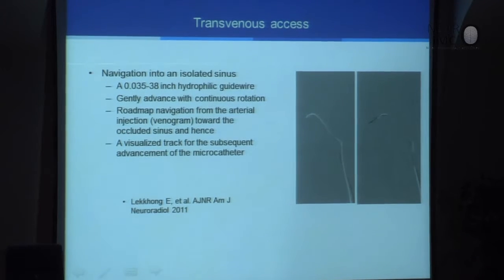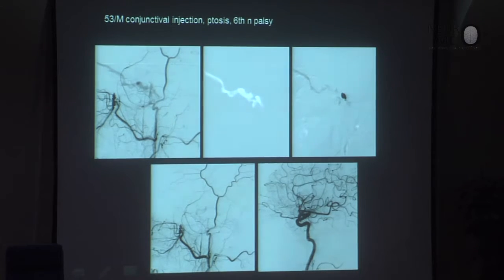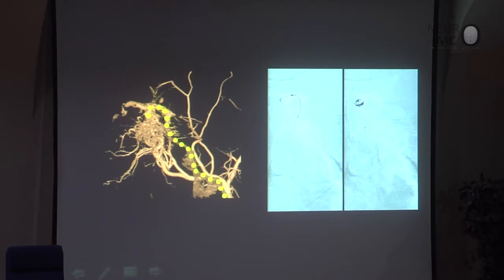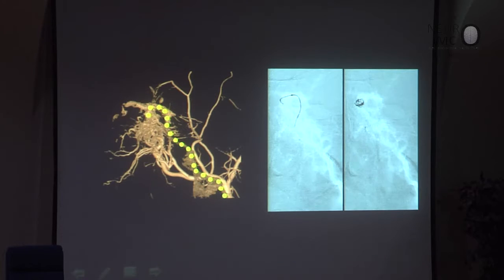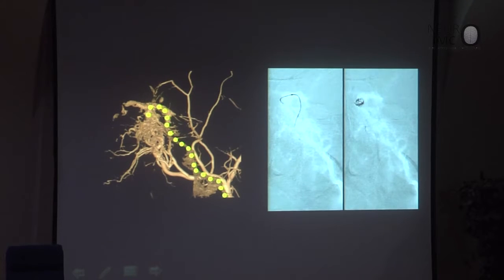We usually try transvenous access, as you see here. This procedure is most effective in the restrictive phase because antegrade venous occlusion is there. It's a little easier to find the fistula pouch when we approach through the occluded vein or the opposite side into the fistula point. So we occlude the fistula point and then we can get complete obliteration. Sometimes it's necessary, as in aneurysm embolization, to shape the microcatheter to find the fistula point. Otherwise, it's sometimes very difficult to get into the fistula point.